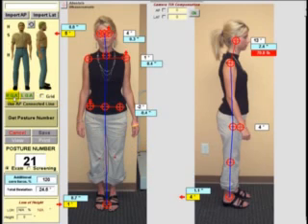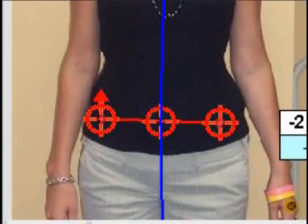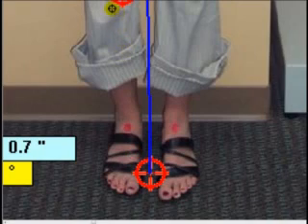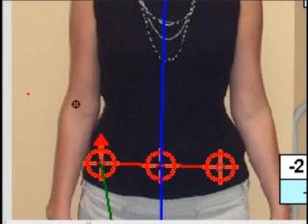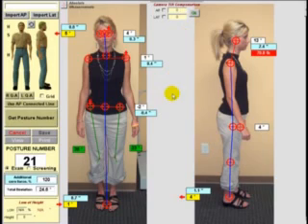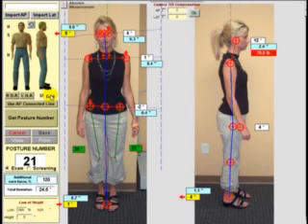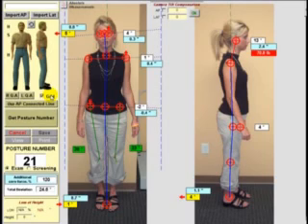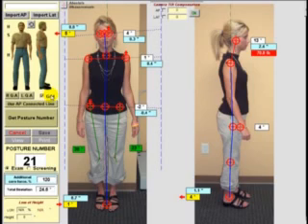And if you want to do a Q angle exam, again we've automated the use of the Q angle so that it jumps down and automatically goes to the points to measure. It leaves the crosshairs on the screen. We have found that visually this provides much greater and immediate impact to the patient by showing them that all of these points should either be level or plumb vertical. It makes for an analysis and a report that is more dynamic and makes a greater impact on the patient. These are some of the changes to increase speed and accuracy that we've built into PosturePro E.